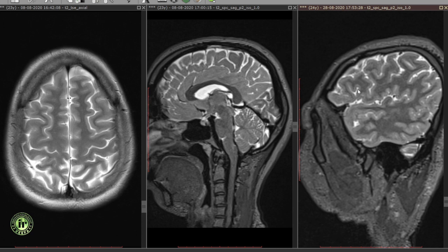On the lateral sagittal images, a Y-shaped sulcus is formed by the anterior horizontal ramus of the inferior frontal gyrus and the ascending ramus of the sylvian fissure. The next major fissure posteriorly is the precentral sulcus, with the central sulcus being the next major fissure posteriorly.